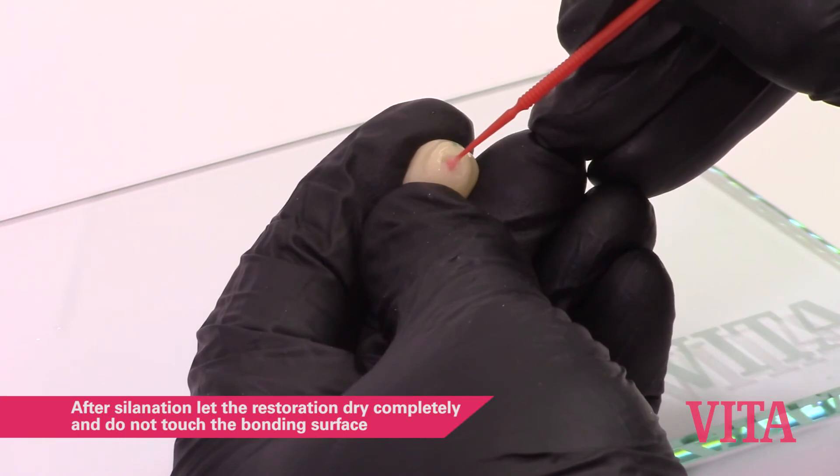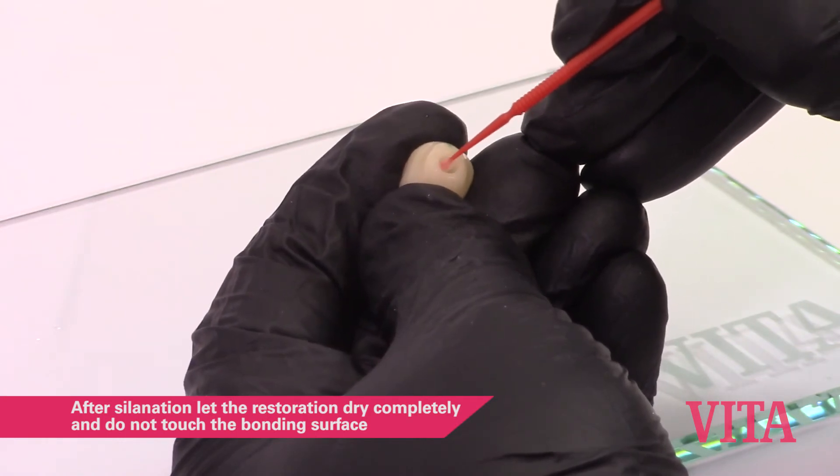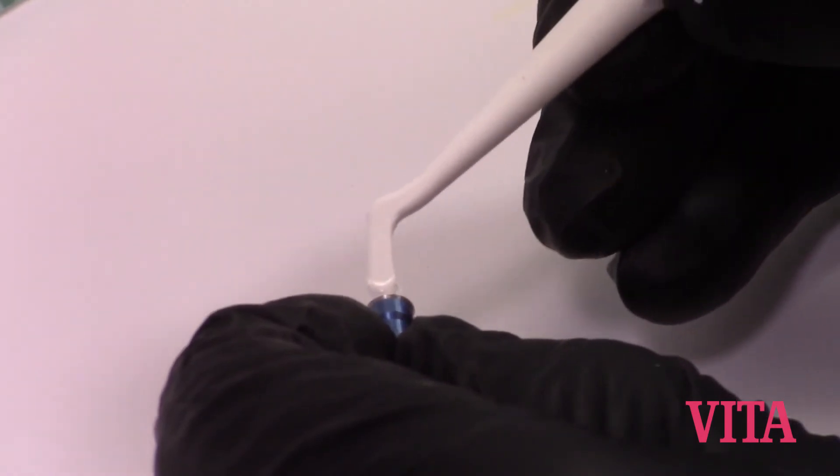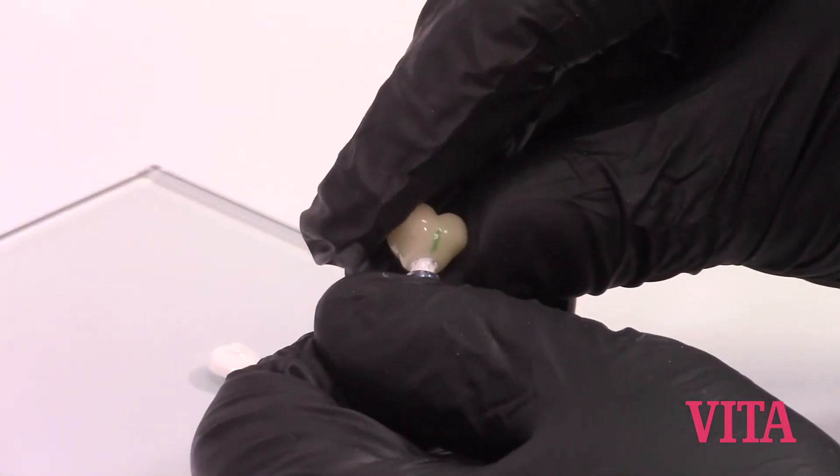Silinate the etched area in the intaglio of the restoration. We're going to use, in this case example, Multi-link hybrid abutment self-curing luting composite.